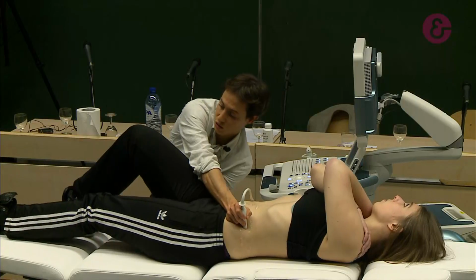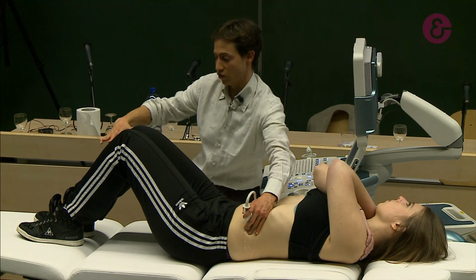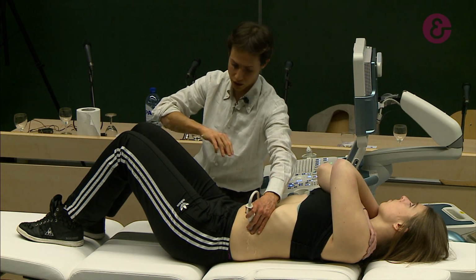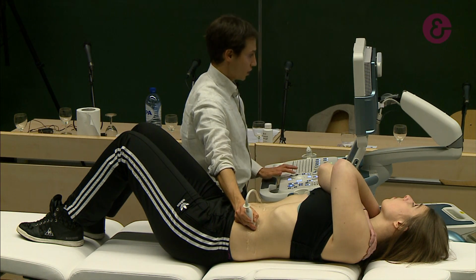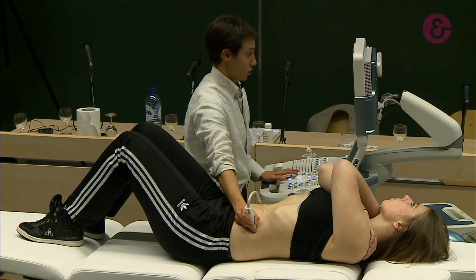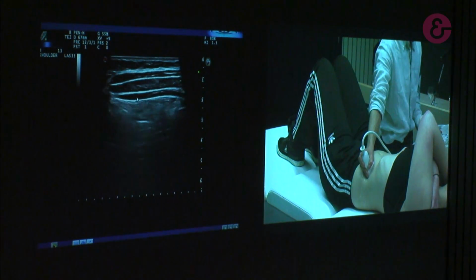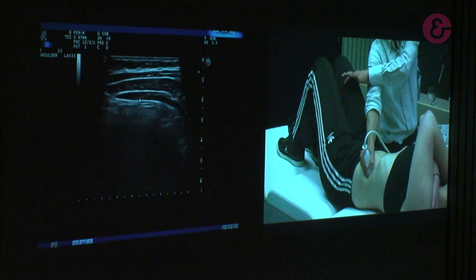Can you bend your knee? So now I will ask her to move this leg up, so flexion of the hip, because I want to create a perturbation for the back. So I want to be sure that she's able to activate, to keep this muscle on during a perturbation. So can you breathe in, breathe out, and stop breathing. Okay, very good. And now start moving.